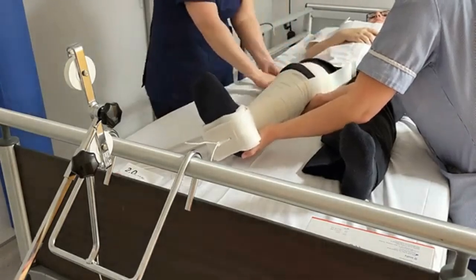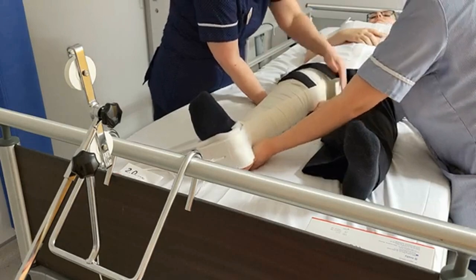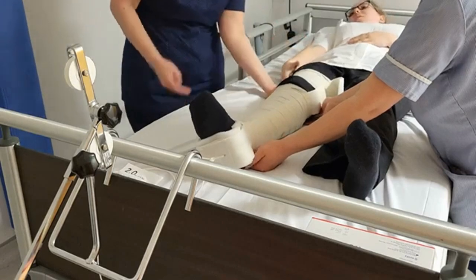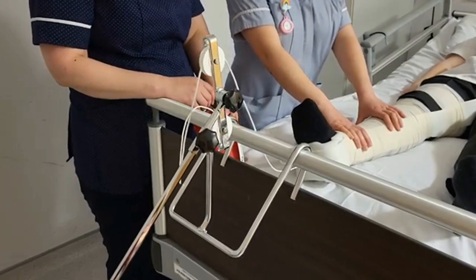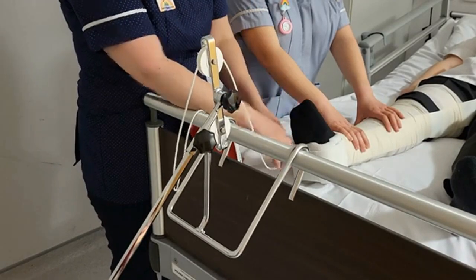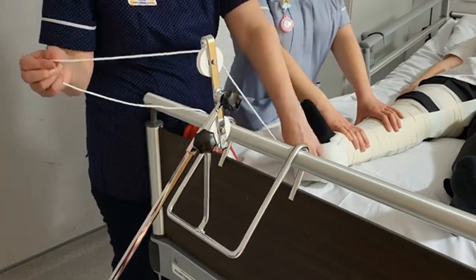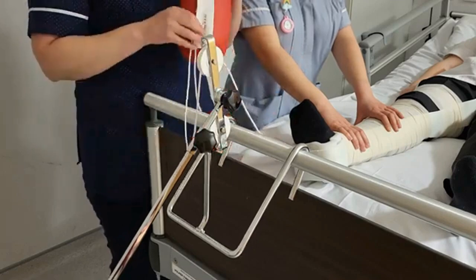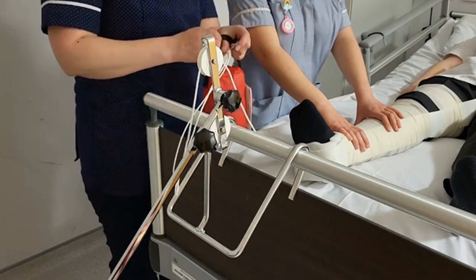Continue the new bandage as high as you can, as far as the bandage will allow. You can trim off the end bits so they don't get in the way, and tape off the bandage underneath where it finishes. Once the bandage is all done, we're going to attach the traction. While my colleague is still holding the leg, I have my traction cord, made shorter to just one string, with the other string tied in with a double clove hitch. Go through the top pulley and attach again with a double clove hitch knot on the end.